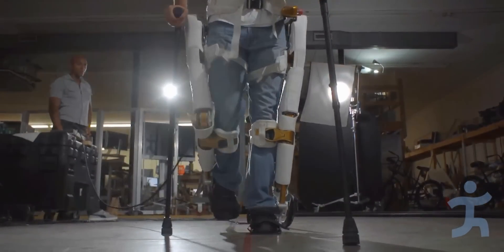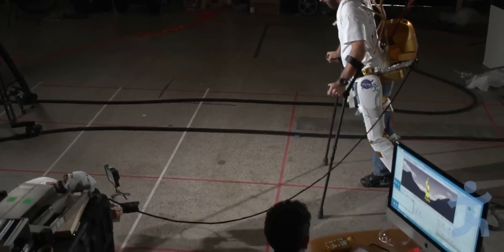Our next step is to do testing with a person who has a spinal cord injury and is paralyzed.